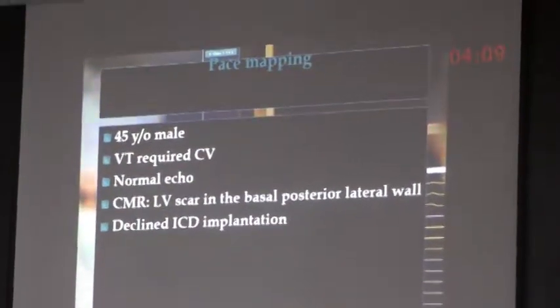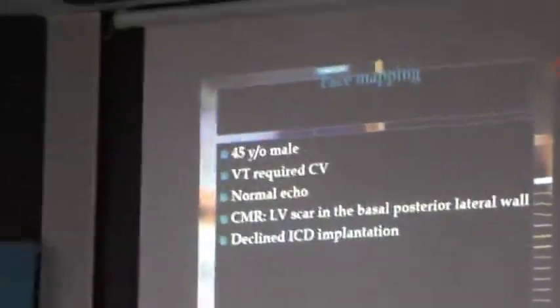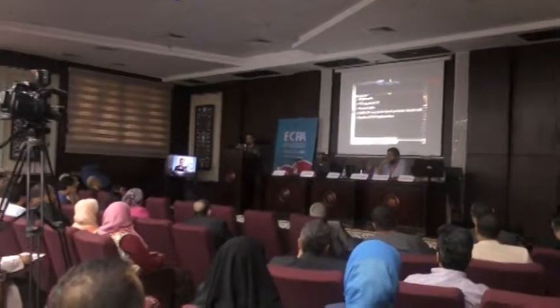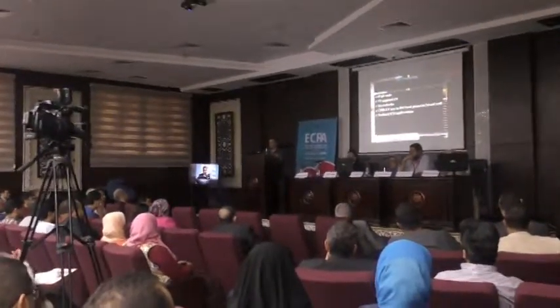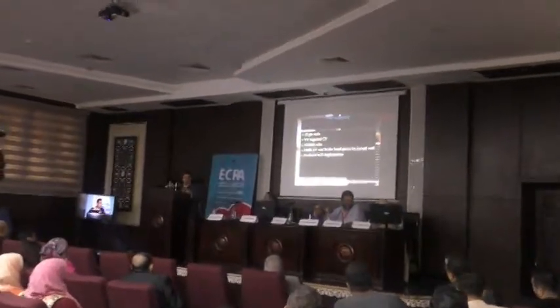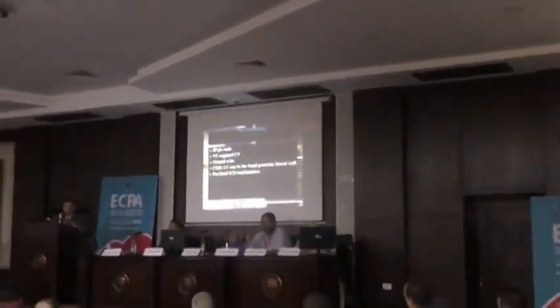Dr. Naim, do you use it? Clinical VT, stable, slow VT. Yeah, it's good for when you are in a good mood and you want to make good slides to do an entrainment mapping. But I think the activation mapping now is the most important thing.